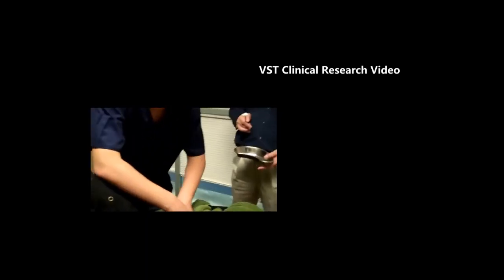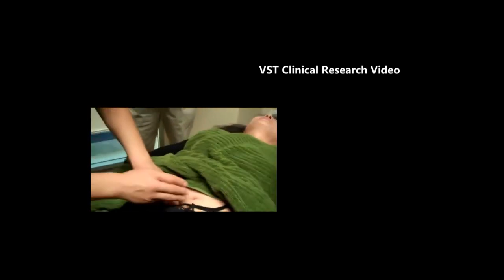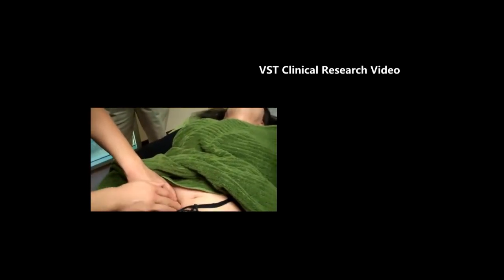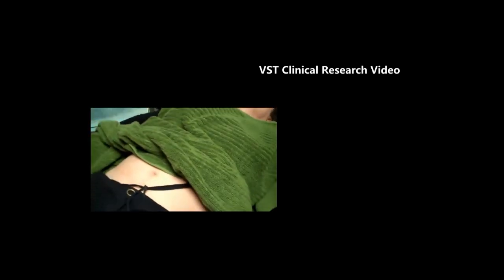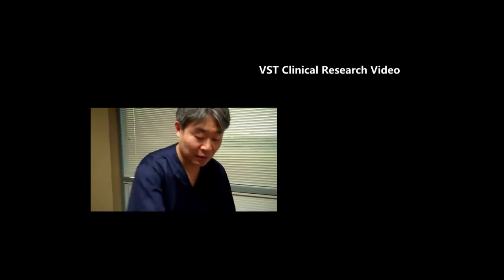Could you straighten your leg? Usually, just with massaging in deep muscle, you can release that area. In some cases, we need to insert needle into the psoas muscle directly. For that, let the patient lie with her left side down.